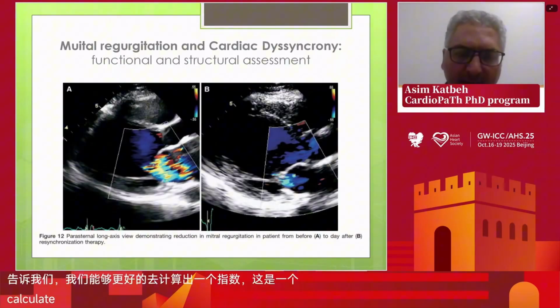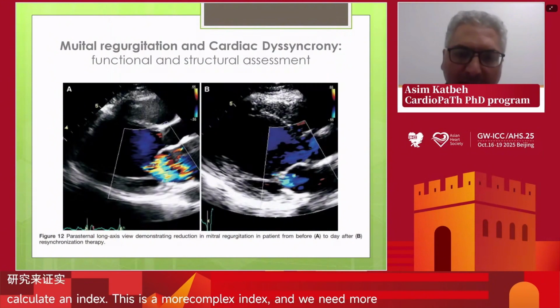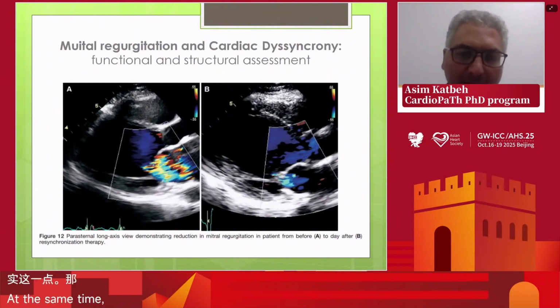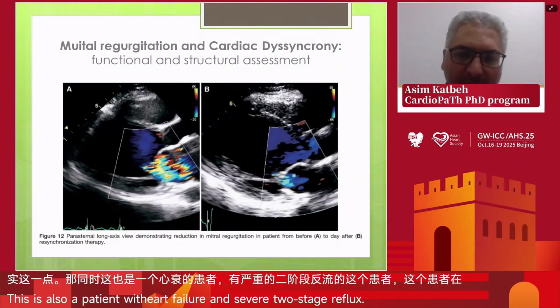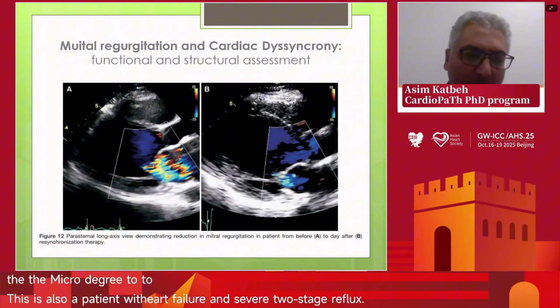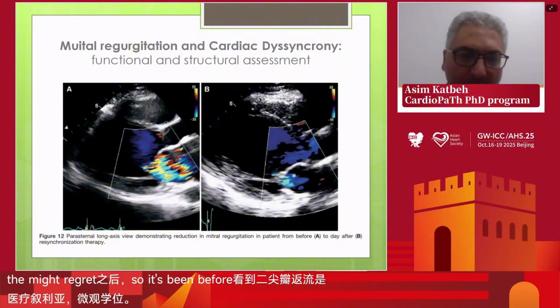And also this example of a patient with heart failure and severe mitral regurgitation. After 6 months of CRT device implantation and optimal medical therapy, the mitral regurgitation showed improvement. So it's very important to wait 6 months after CRT implantation to evaluate the valve.